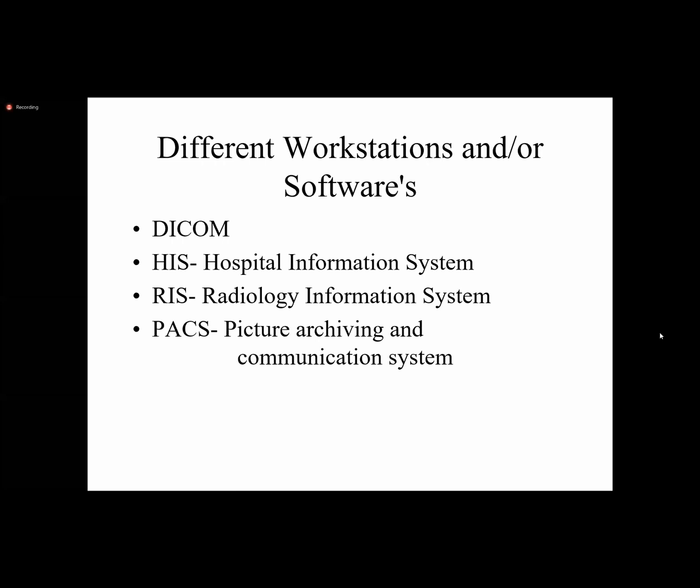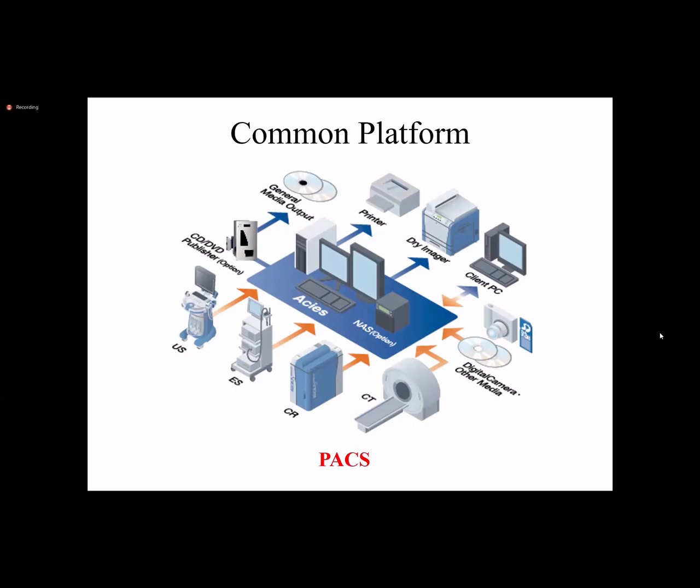Next we have the Picture Archiving and Communication System. This is the most important software or system required in the hospital nowadays. We can say PACS is the biggest picture, PACS is the top of them, and then HIS can work, then RIS can work. That means in the PACS software we can operate the HIS as well as the RIS. So yes, this is the PACS.